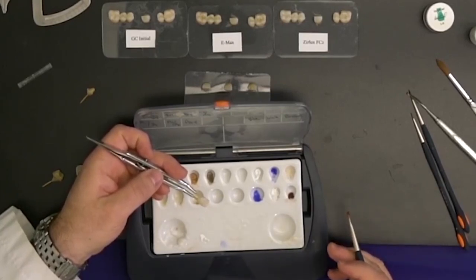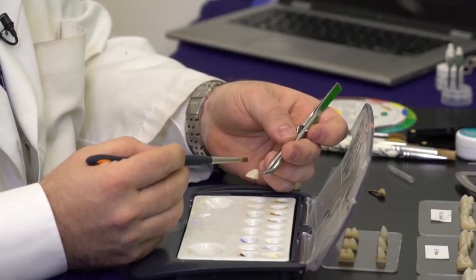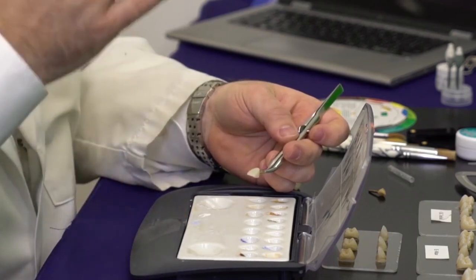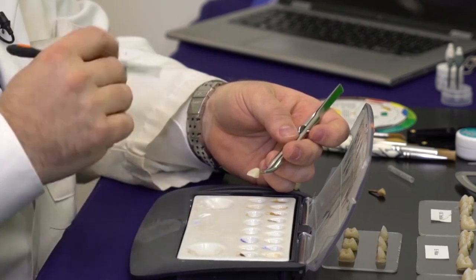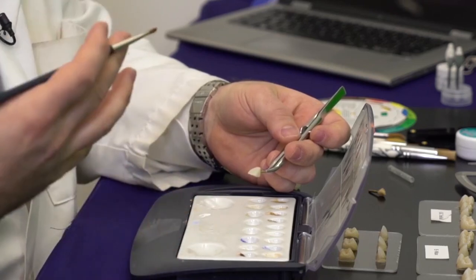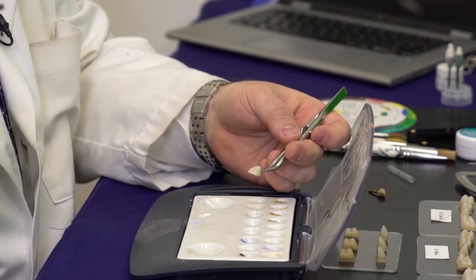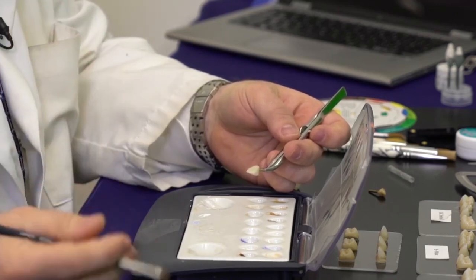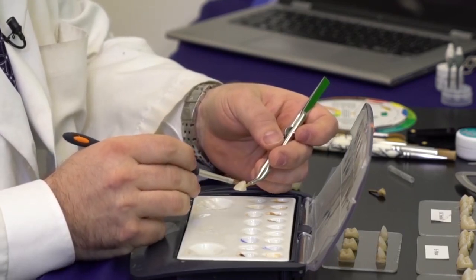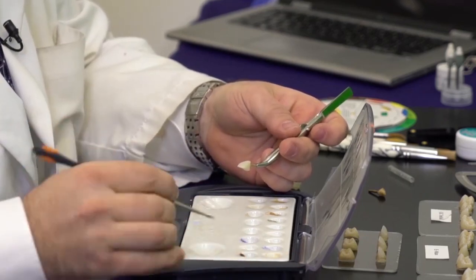We want to simulate that in the actual restoration as well. So in my pre-sintering in the green state, I place it where I round those high spots and create a little bit of texture deeper in the developmental grooves and less at the height of contour and the mesial and distal — because when light reflects on it, it bounces back and gives it that high shine and vitality. Having done that in the pre-sinter stage, we can now lightly put a thick enough neutral on it in order to be able to stain it.